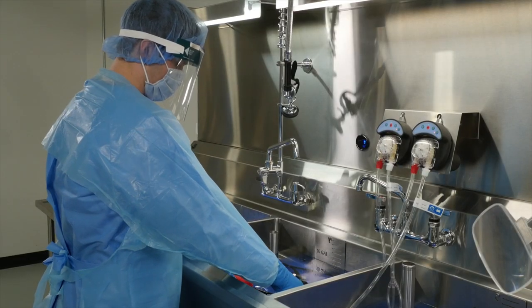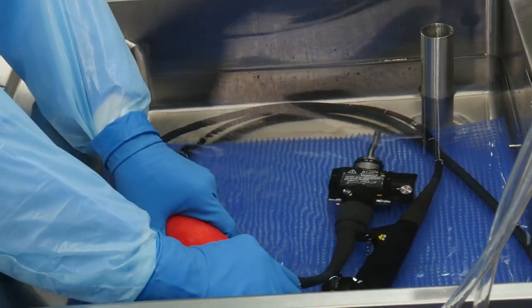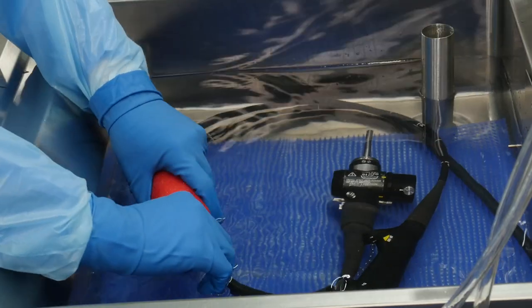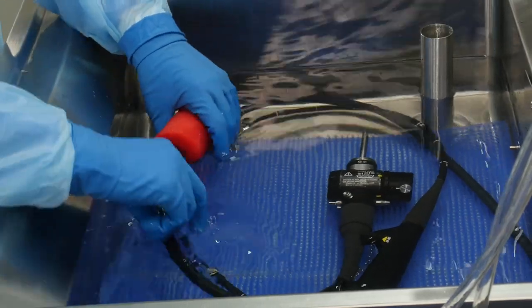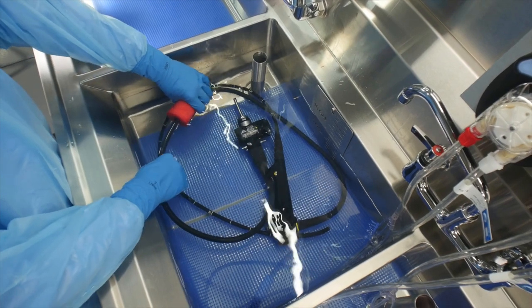Once leak testing confirms that the scope isn't compromised in any way, manual cleaning begins. ST91 guidelines recommend a multi-sink workflow to accommodate the necessary steps for cleaning and disinfecting scopes.